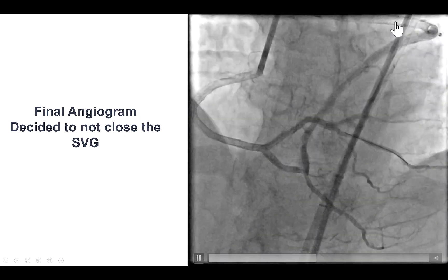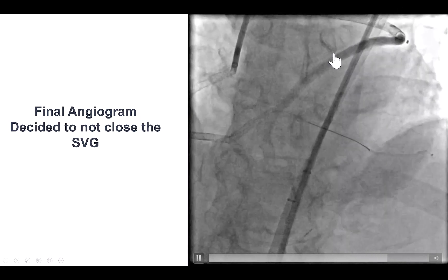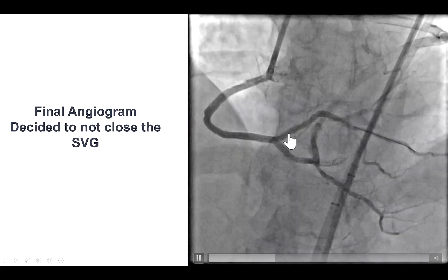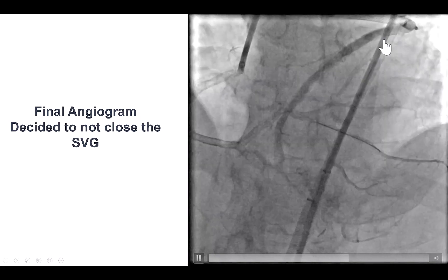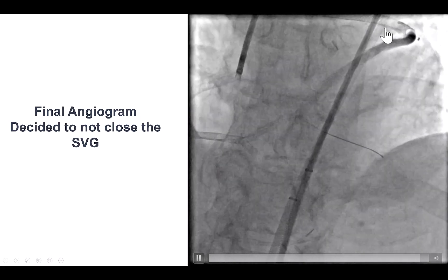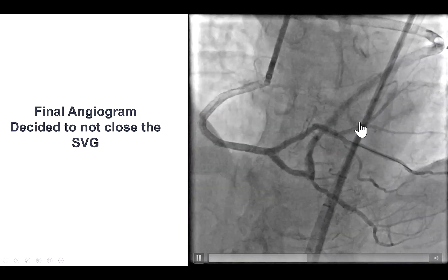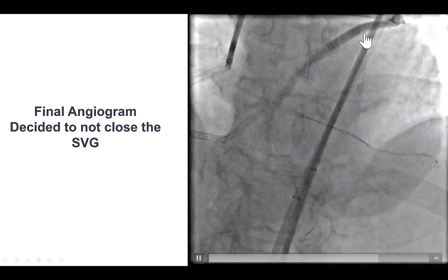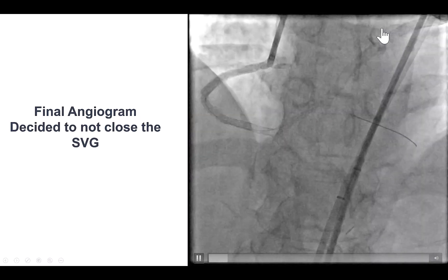Sometimes we occlude the saphenous vein graft to prevent competitive flow. Here, the flow was mainly antegrade. Moreover, we had this obtuse marginal — a very small branch that was filling through the graft — so we decided not to occlude the saphenous vein graft.